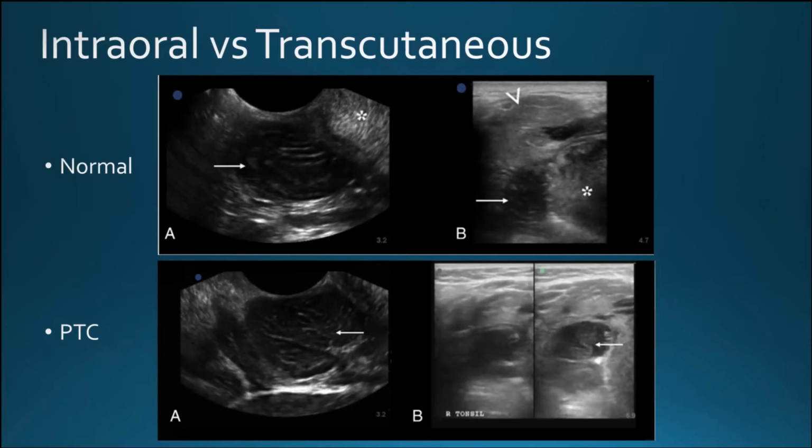Now versus the cellulitis that we have down here. For a cellulitic tonsil, these are going to be enlarged, in excess of 20 millimeters. They're going to have a homogeneous, or sometimes a striated, texture within the tonsil itself. When you see that, it's likely going to be considered a cellulitis.